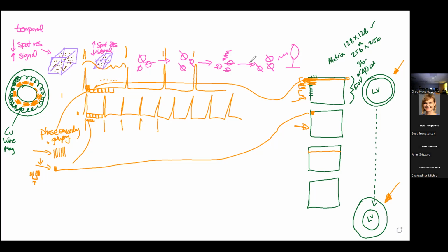Everybody got that? How will you know that your temporal resolution is inadequate? The image is going to appear smudged. Okay? If it's a blurry, smudged image, you got one of a couple things happening. Either, we'll talk about this in a minute, either A, we're not finding these QRS complexes from which to initiate the trigger, or we've got an issue with this heart rate thing. Okay? Next. Any questions? All right.